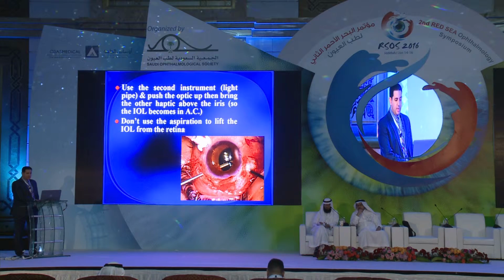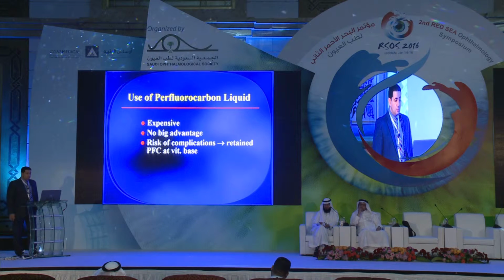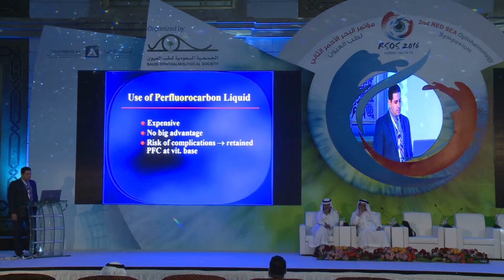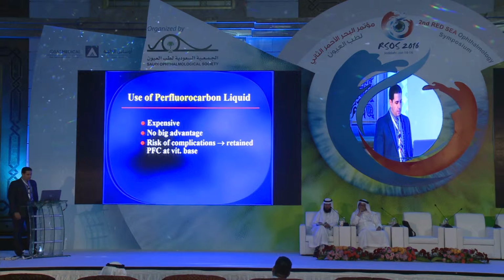Don't use aspiration to lift the IOL, because there is a very high risk of it falling onto the retina. The use of perfluorocarbon liquid is debated. It's expensive, with no big advantage, and there is a risk of complications from retained PFCL at the vitreous base, but some surgeons prefer to use PFCL to protect the retina from trauma if the IOL falls again.